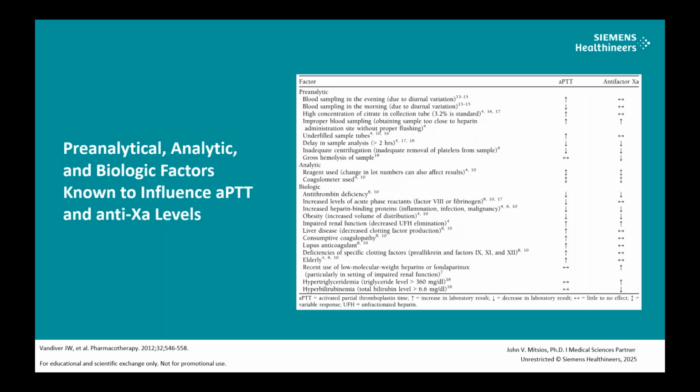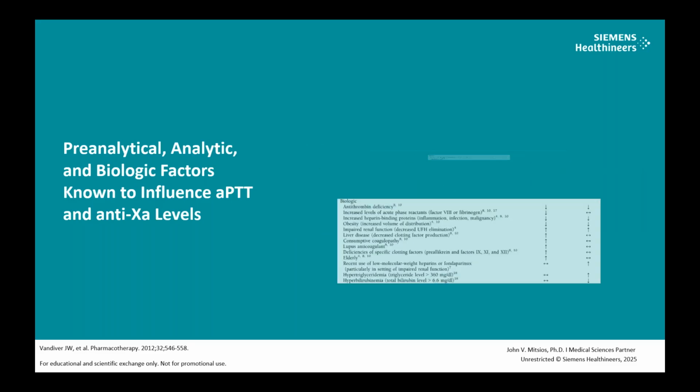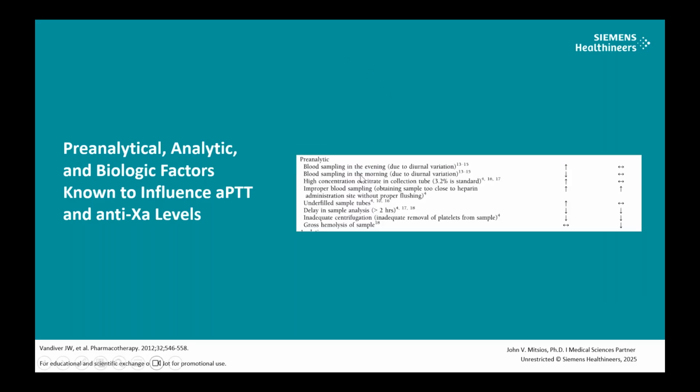So when we think of a number of pre-analytical, analytical, and biological factors that can influence your PTT and anti-10A, right? Well, pre-analytical, we know that is probably one of the highest sources of errors in the lab. About 70% of those errors come in as pre-analytical, and specifically, you can see here there are fewer pre-analytical variables that can affect your anti-10A assay versus your PTT. For example, if we're looking at pre-analytics here, we're looking at blood sample diurnal variations, not really affecting your anti-10A, but your PTT will in fact be affected.